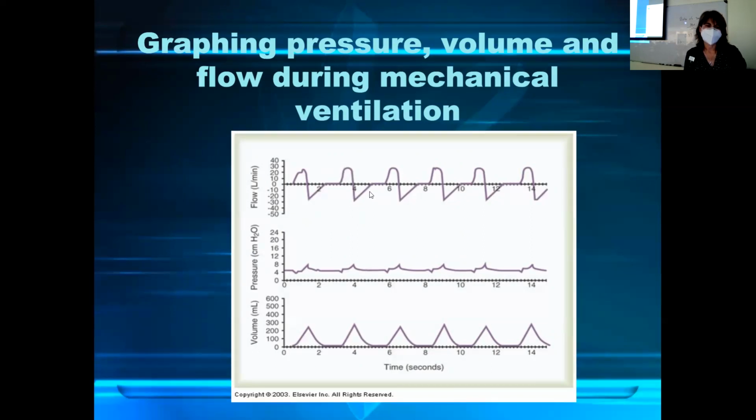This is the air coming back out of the lungs. So if we had to label it on a test, exhalation only starts at the very bottom of that triangle. Yes. Yeah, so everything below baseline is considered exhalation. And again, this straight line is all one point in time.